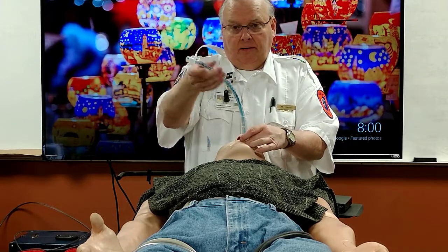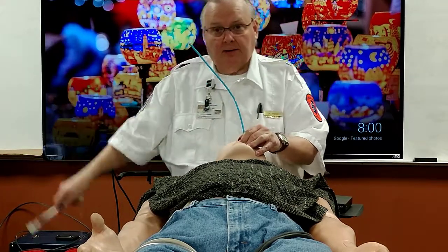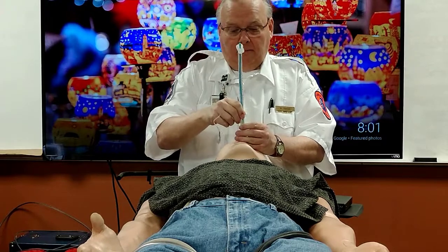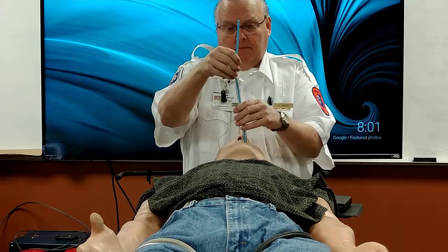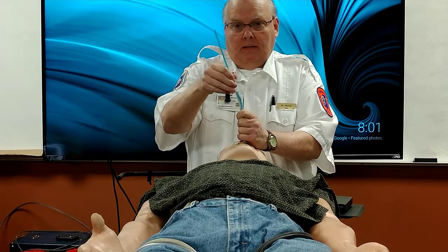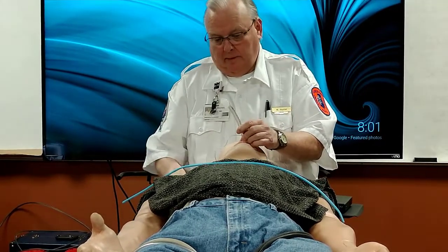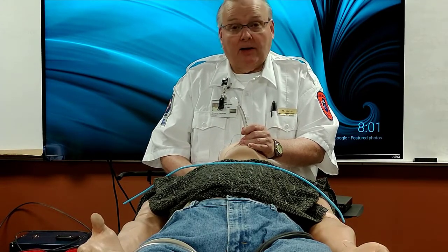Until you can grab the bougie toward the bottom, making sure the bougie does not come dislodged. You're going to discard this tube, and then you're going to get your new tube. Again, still holding onto the bougie. Load your tube onto your bougie. Put it right down back through there, and then pull your bougie out. Reinflate your cuff and ventilate, putting on your end-tidal CO2, checking that, checking your lung sounds, etc.